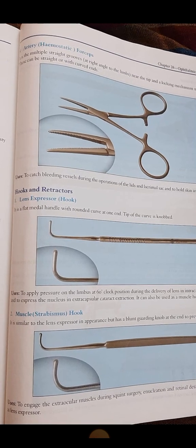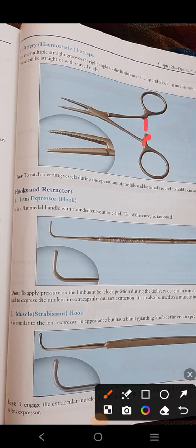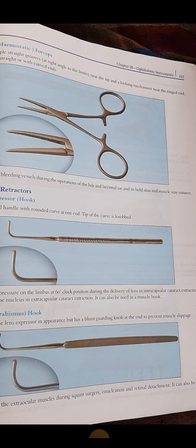The artery forceps — remember it is not scissors, even though it looks like scissors. It has a locking mechanism near its rings and fine grooves at its tip. There is no screw present. It is also known as hemostatic forceps. As the name indicates, it is used to catch any bleeding point — like when performing any operation on the lids or lacrimal sac — to catch bleeding vessels. It is also used to hold skin and muscle sutures. We will cover the next instruments in the next part, inshallah.